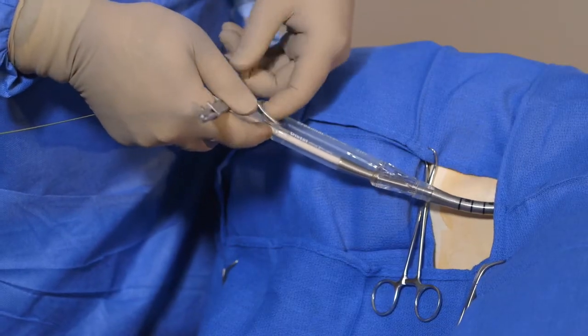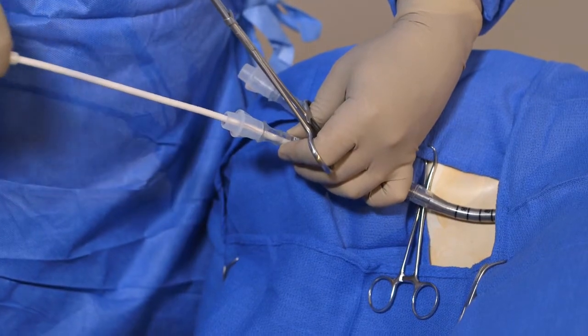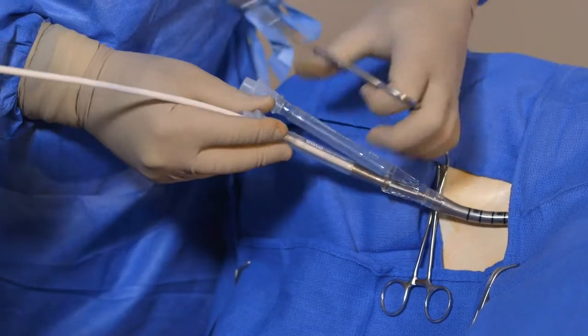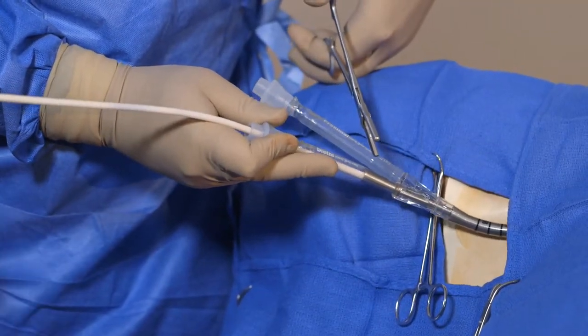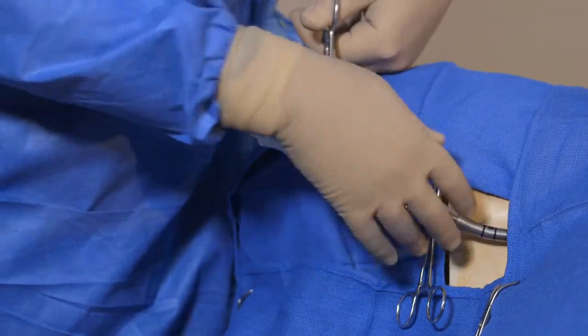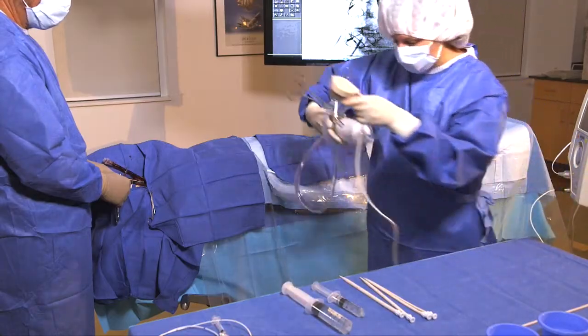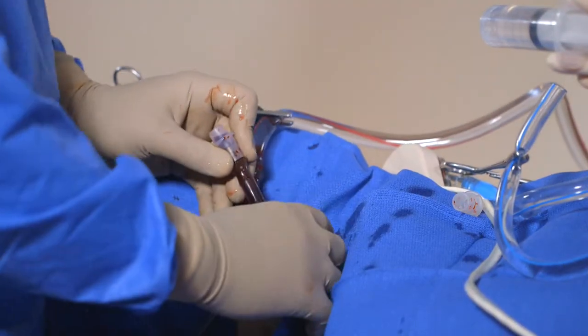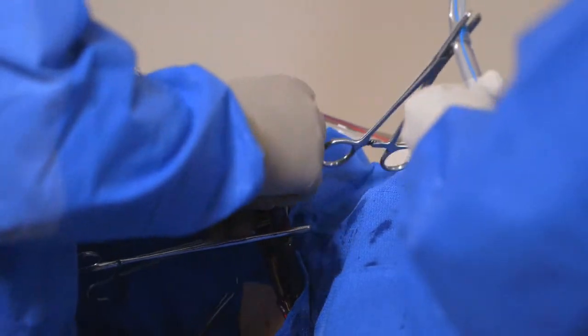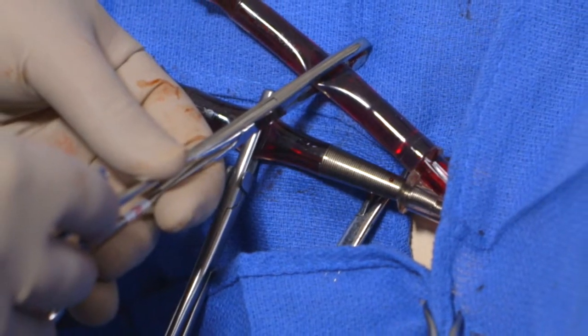Next, remove the guide wire and introducer until they are beyond the clamp area of the cannula. Then, leaving the hemostasis valve in place temporarily to control blood loss, clamp the cannula in the clamp area. Remove the hemostasis valve from the cannula port marked PROXIMAL, backbleed, and clamp the cannula in the clamp area.